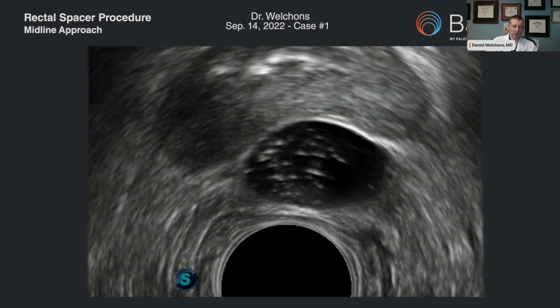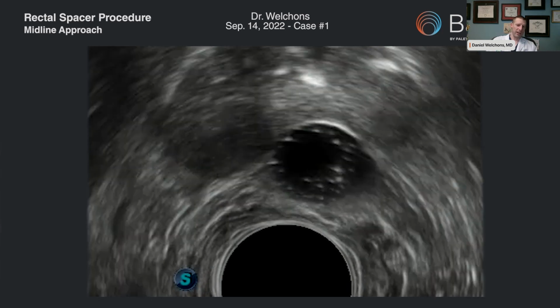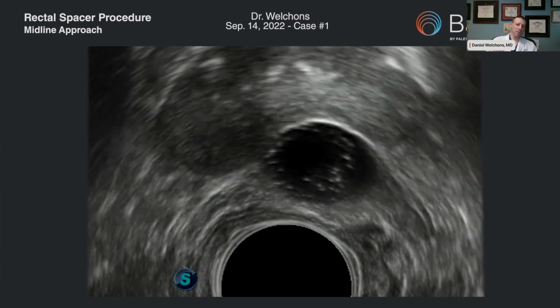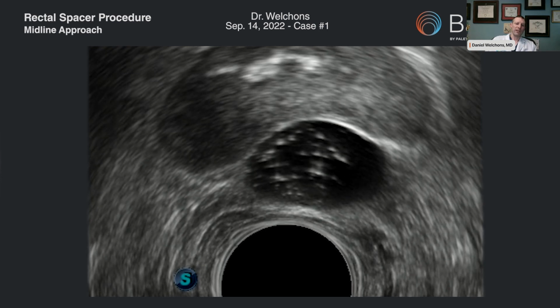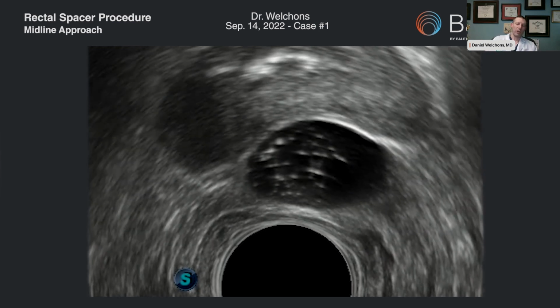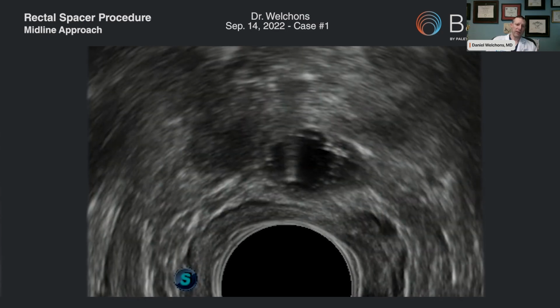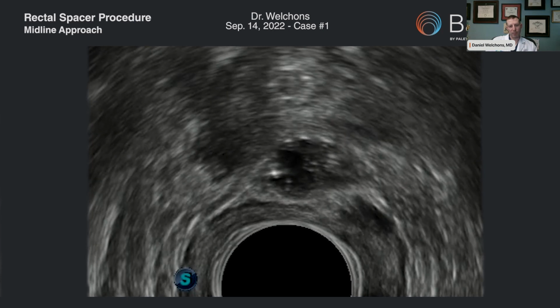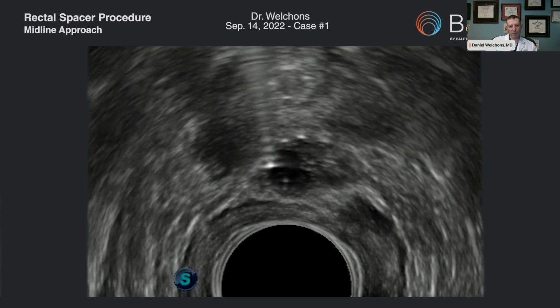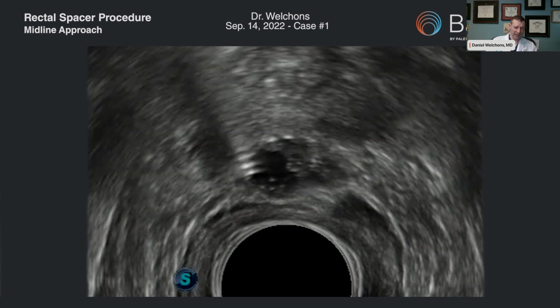And in this particular situation, there was some scarring. You can see the base looks good. We move back in the axial view, and there's still a great space there, but as you move towards the apex, you see the prostate's kind of draped around the gel spacer. And so we might look to add some gel to the left side or the right side to improve our maximal spacing. Right here, we're right at the apex.